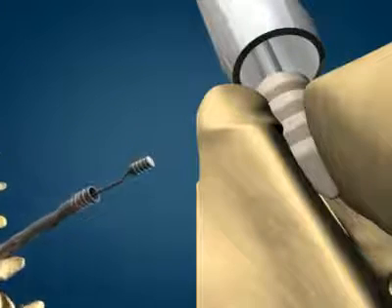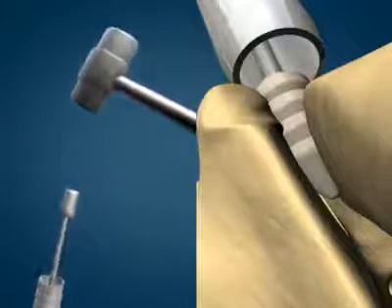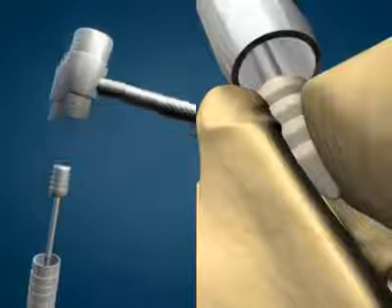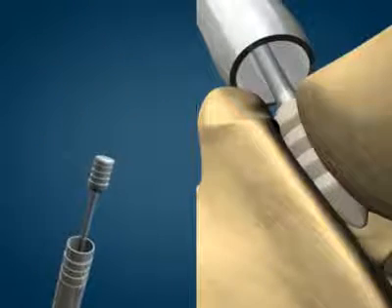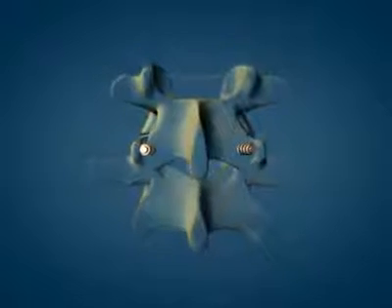If NuFix is not inserted deeply enough at the end of the procedure, it can be inserted more deeply by using the facet sound through dilation tube three. The same steps are repeated for the other facet joint located at that level.